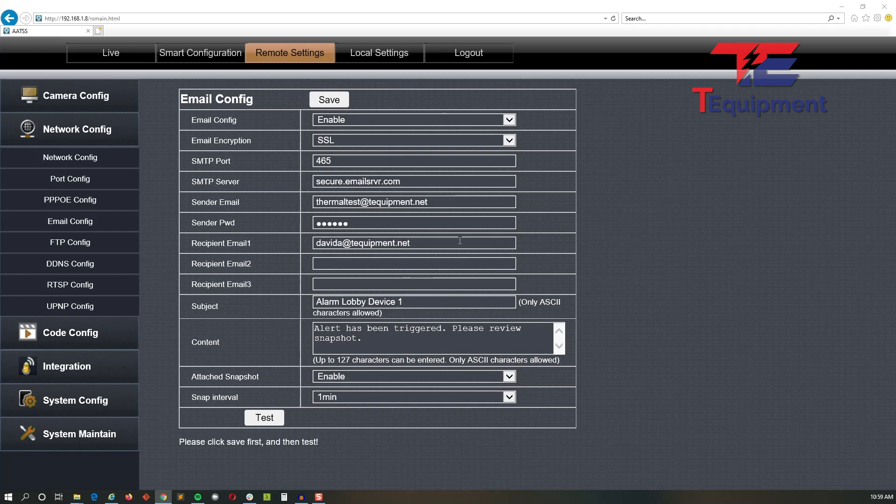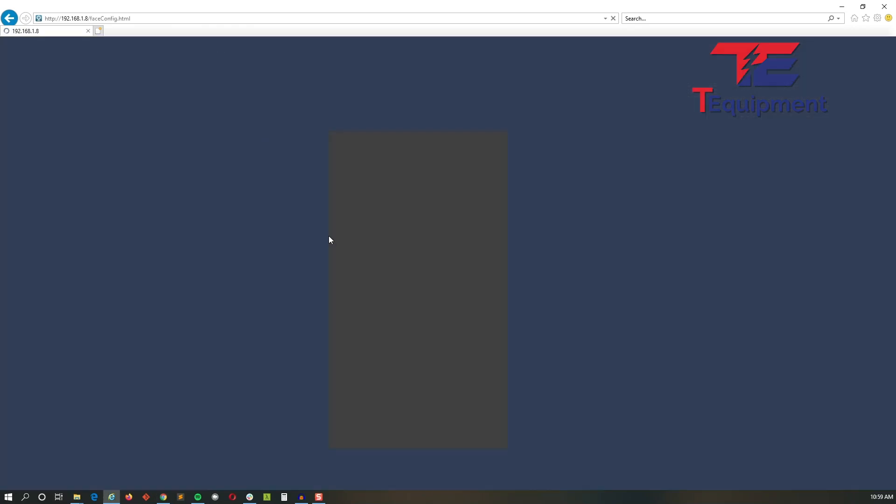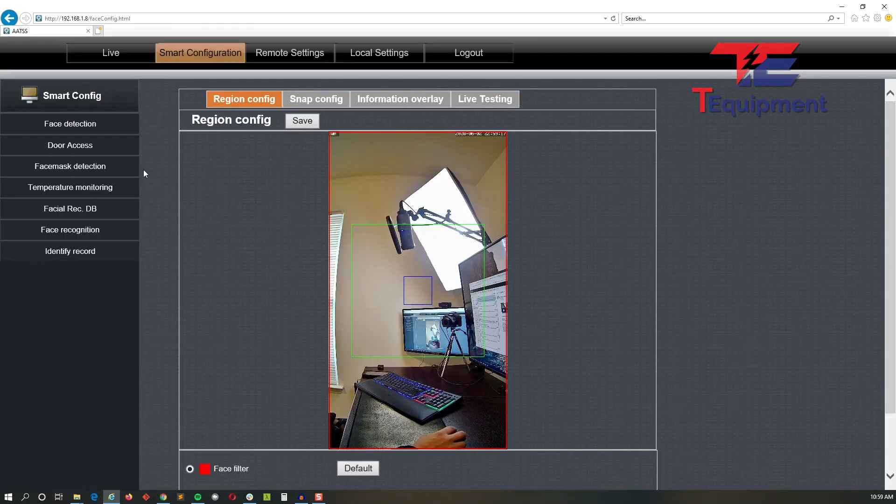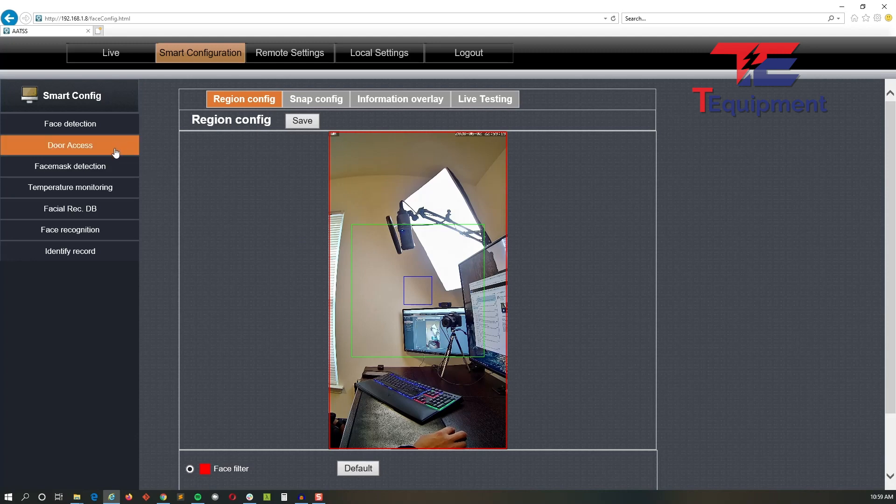And this is how you set up the email configuration on the device. The next part is actually enabling the alarm to trigger for the email. So we're going to go back and go into the temperature monitoring setting here under smart configuration.